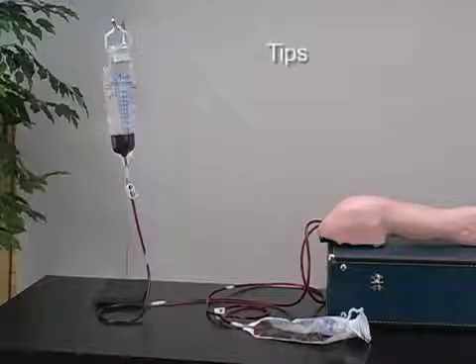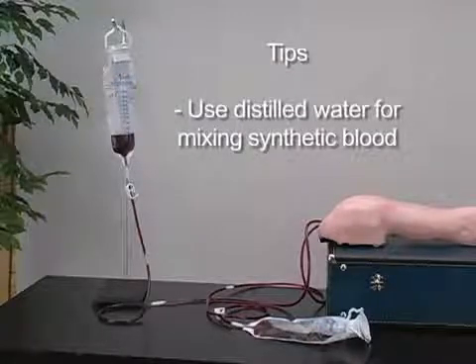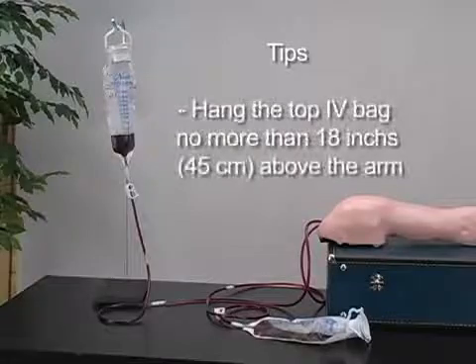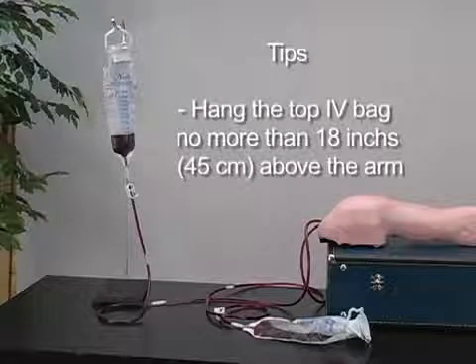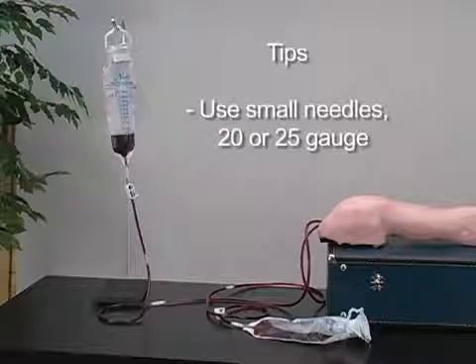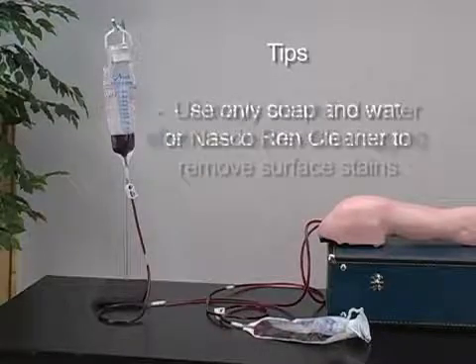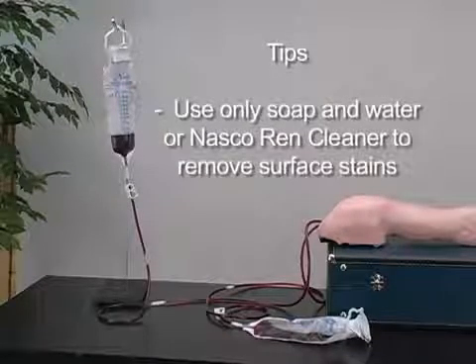To extend the life of your NASCO Lifeform IV arm, utilize the following tips: use distilled water for mixing the synthetic blood; hang the top IV bag no more than 18 inches above the arm; use small needles, 20 or 25 gauge; always clean the arm after use to prevent clogging of the veins; and use only soap and water or NASCO Ren Cleaner when removing surface stains on the skin.